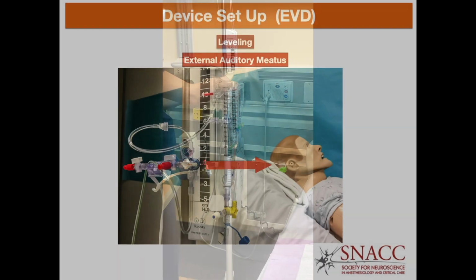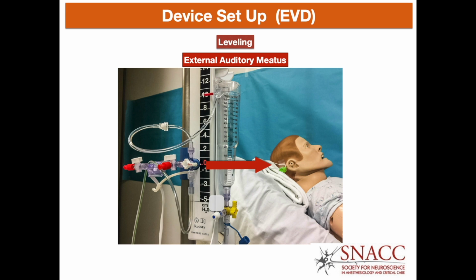Here's another perspective showing the collecting system 0 point, which is collinear with the flushless type transducer, all in line and level to the patient's external auditory meatus.